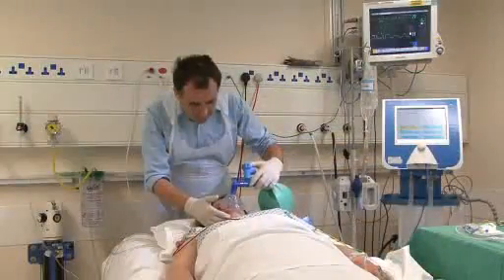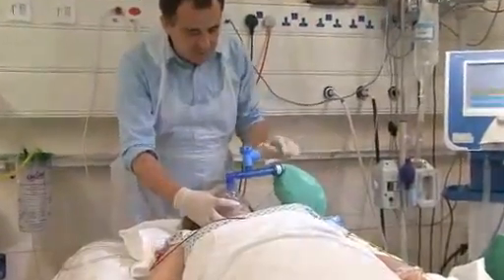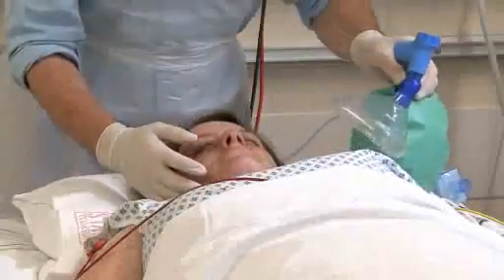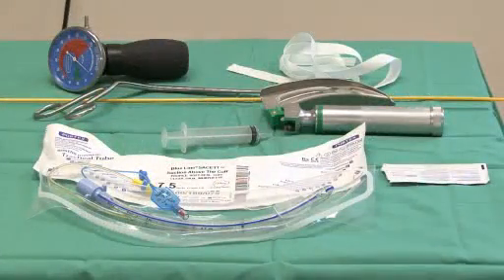Once the patient has been suitably prepared for intubation, the patient is pre-oxygenated and anesthetized in the usual way. Check the patient is adequately anesthetized and ensure all necessary equipment is available.